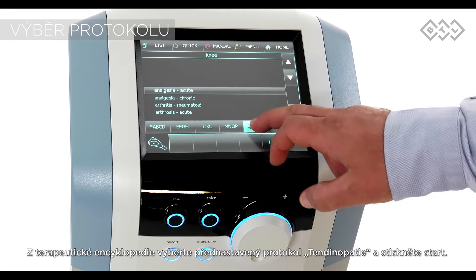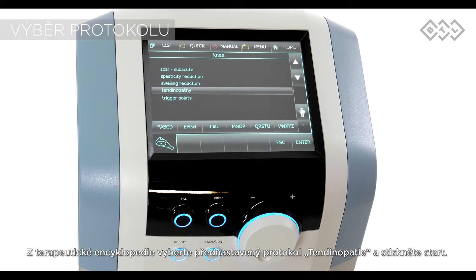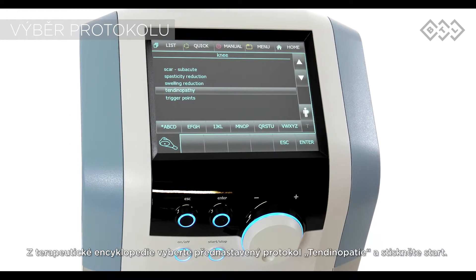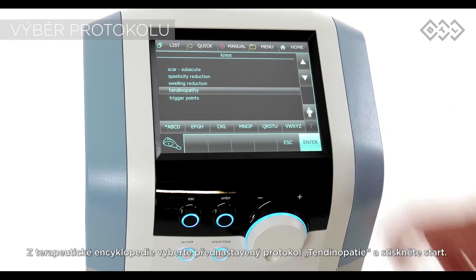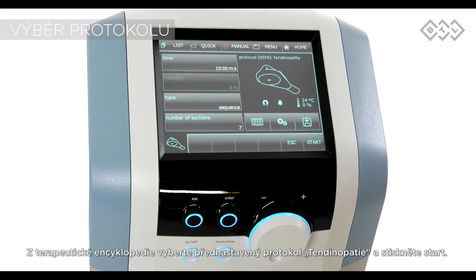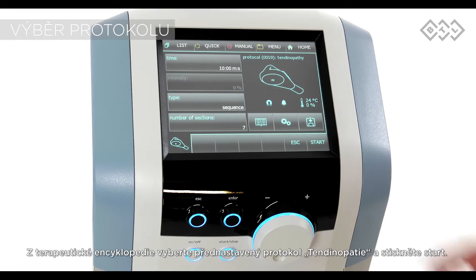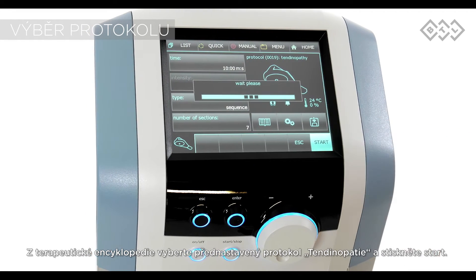To reach the analgesic effect in the treatment of patellar tendinopathy, select the tendinopathy protocol on the main unit and press start.